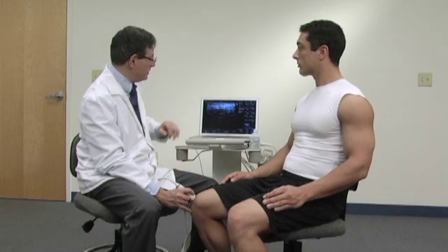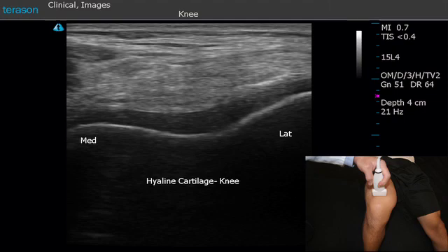Normal hyaline cartilage is very anechoic, meaning that there are no echoes within it because it's mainly made up of water. We can see here the hyaline cartilage of the knee and we see the dark outline of it as it goes in through the area of the trochlea. Above that we see tendon and fatty tissue, which is bright on the image.